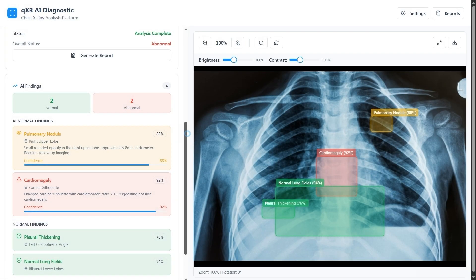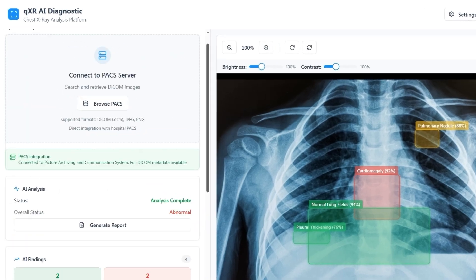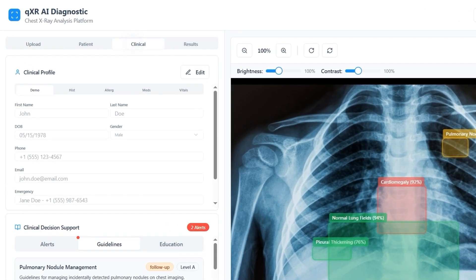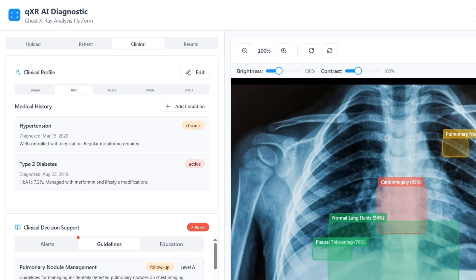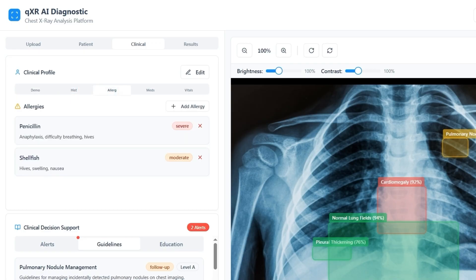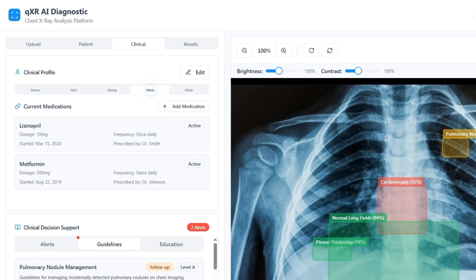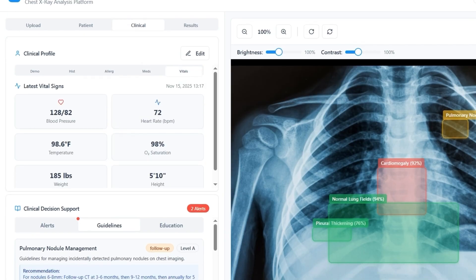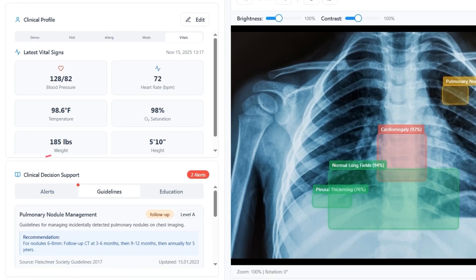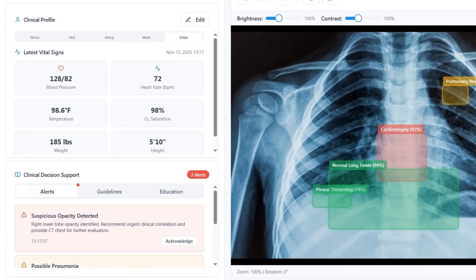When done reviewing, the clinician generates a full analysis report in one click. Under the clinical tab in the AI x-ray diagnostics solution, the clinician views the patient's demographic data, reviews and modifies disease history, allergies, and medications, and examines real-time vital signs.